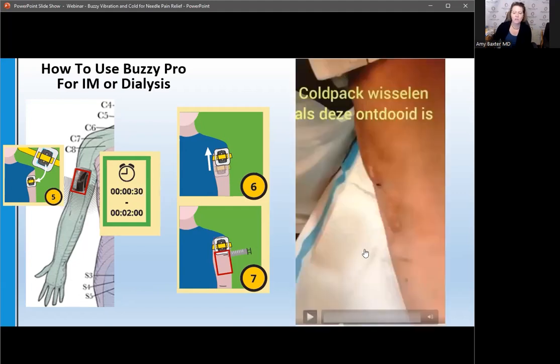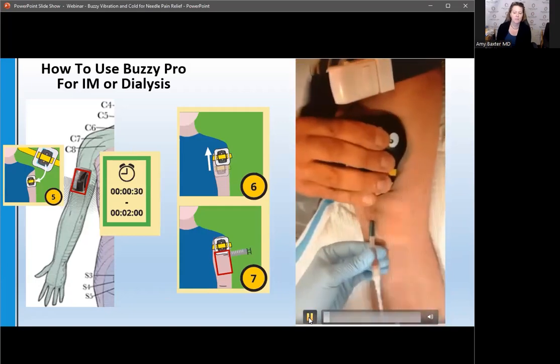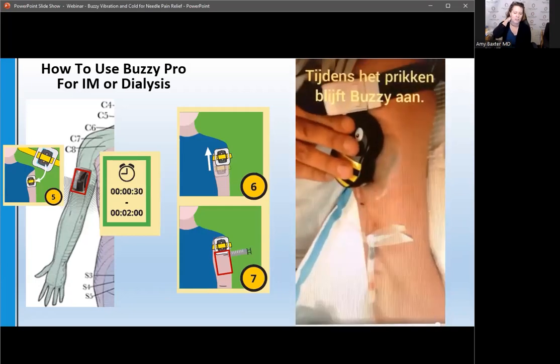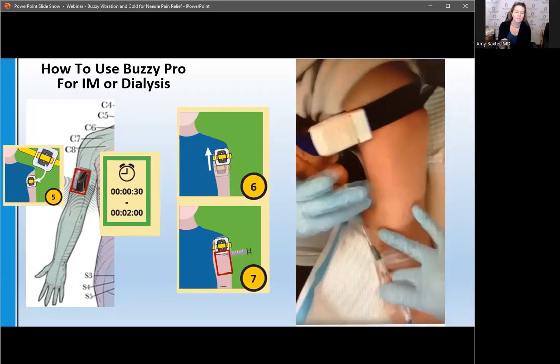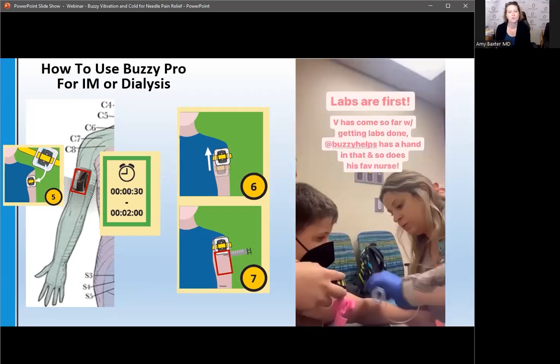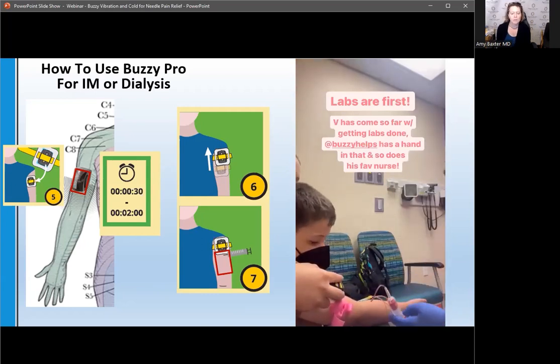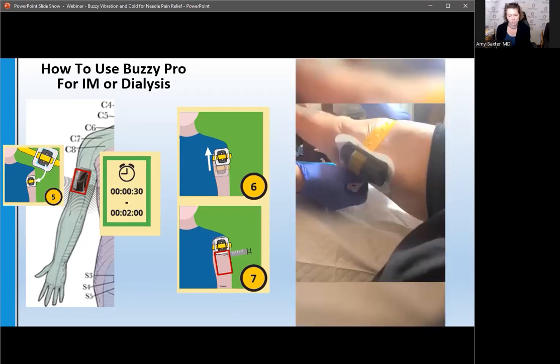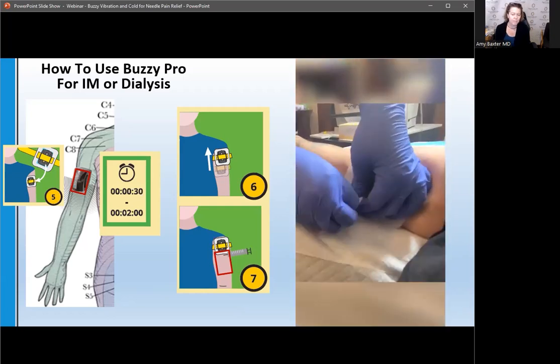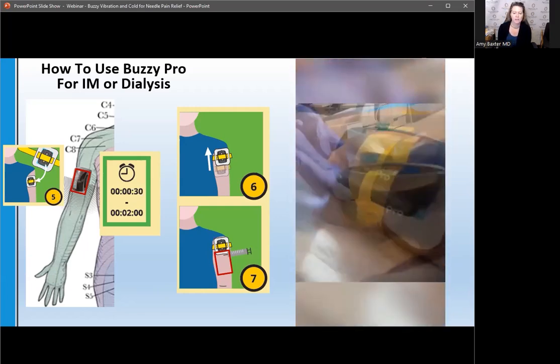So to see what this looks like, here's a little speeded up. So the Buzzy is proximal now. It's already been in the space, but what you're going to see is that they're moving Buzzy up so that then the second cannulation is where Buzzy just was. So here's another option where the parent is holding the device proximal, and because it's an IV, they don't need to leave it. And this is someone who's doing their cannulation for dialysis at home.